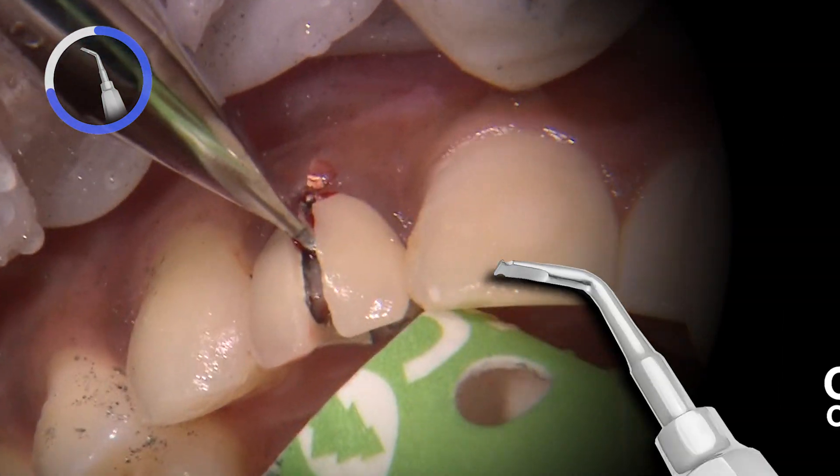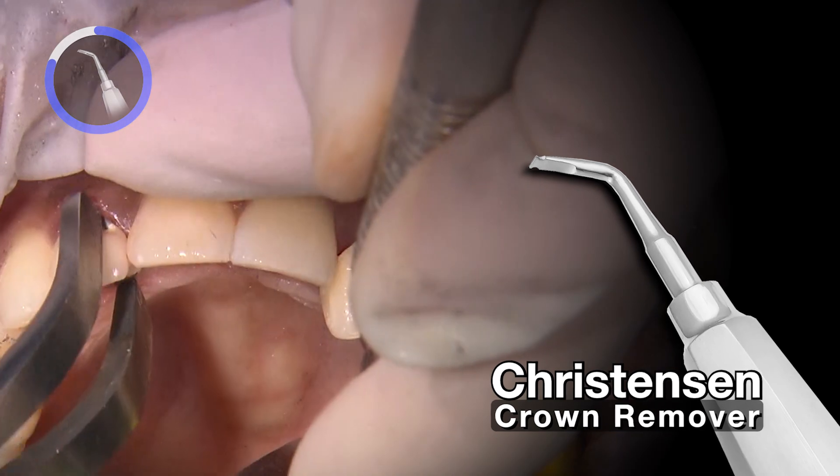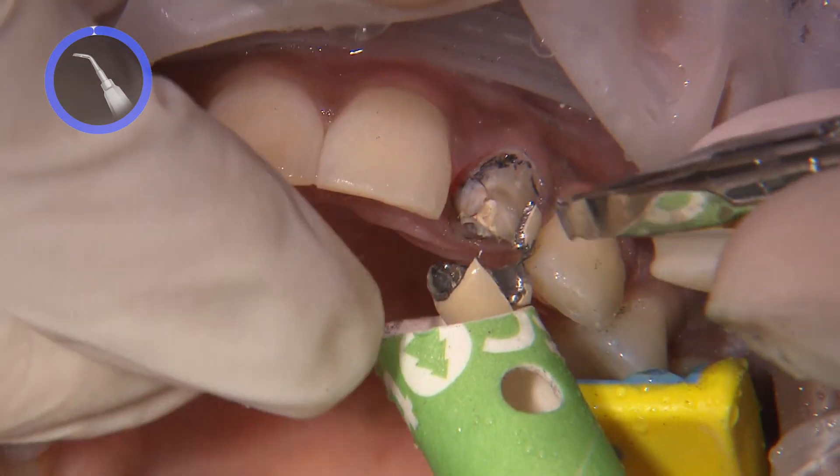Once the slot is large enough, I use a Christensen crown remover to separate the crown from the prep. For more stubborn crowns like on number 10, I make an additional horizontal slot to help with the removal.